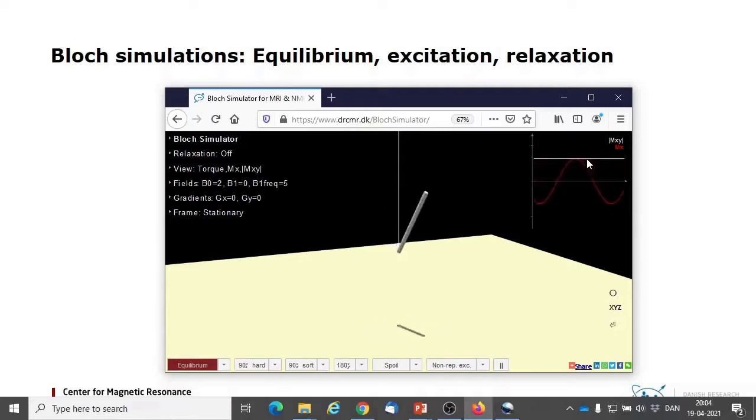Let's start in equilibrium, where the magnetization is longitudinal. With an RF pulse on resonance, the magnetization is rotated into the transversal plane.